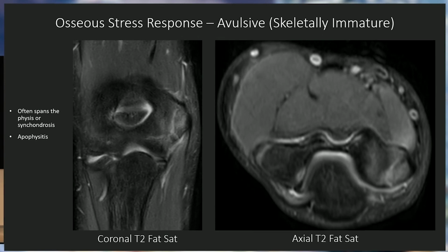So to get to your question, to wrap this up about tug lesions: these are also called cortical avulsion injuries, which I think is a better term. An older term is cortical desmoid. We don't really use that term anymore.